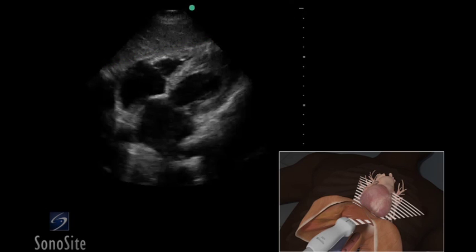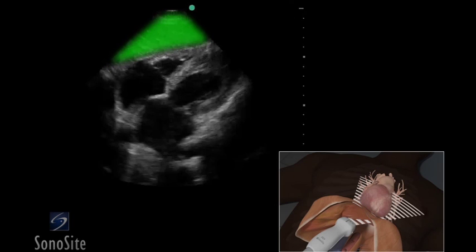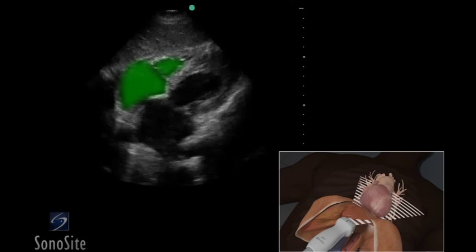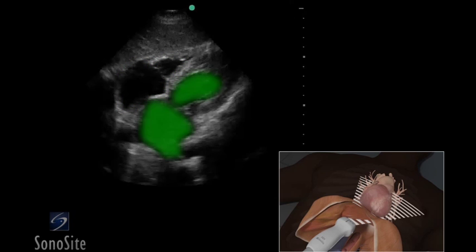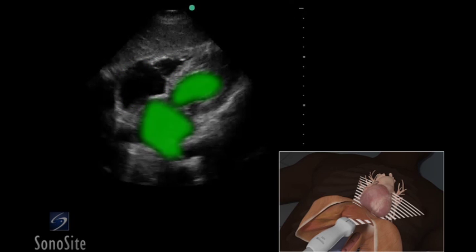The first structure seen closest to the transducer is the liver. The right side of the heart will appear closer to the transducer than the left side of the heart on the ultrasound image.